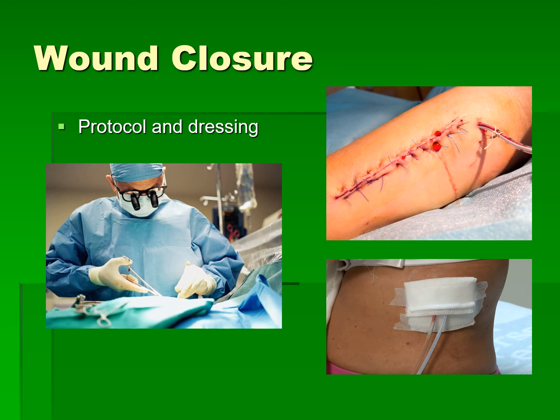You do not want to ever put dressing sponges up on your Mayo stand before the skin is closed. I don't even like them opened up onto my field until we are very near needing them. But you want to anticipate the dressings. You don't want the surgeon to be standing there stomping his or her foot waiting for the dressings. So you want to anticipate those.